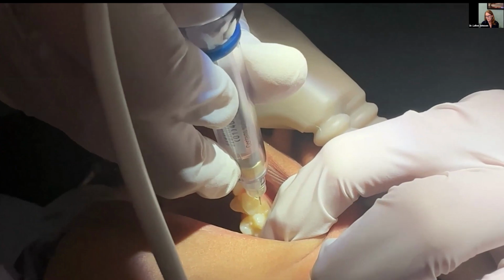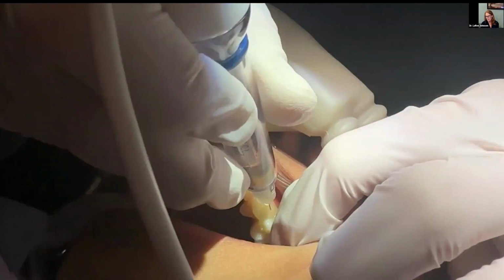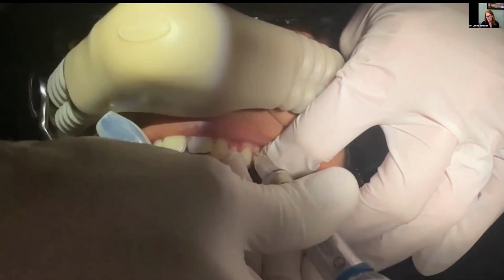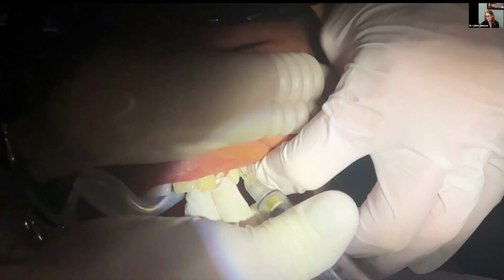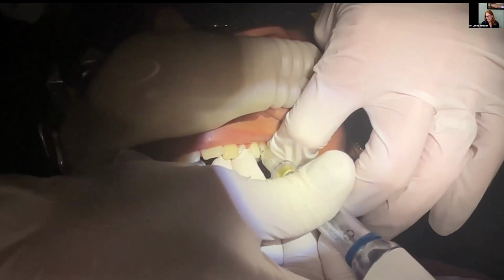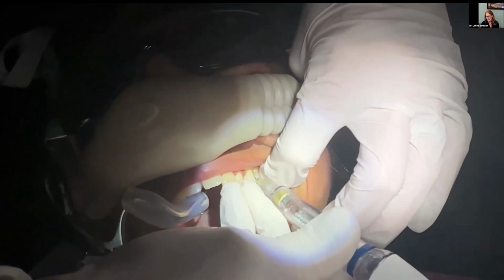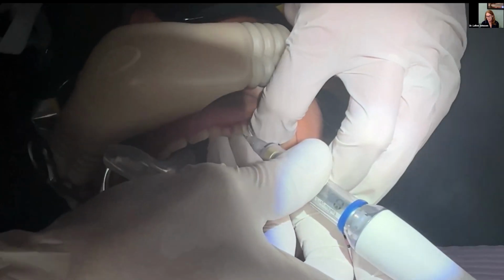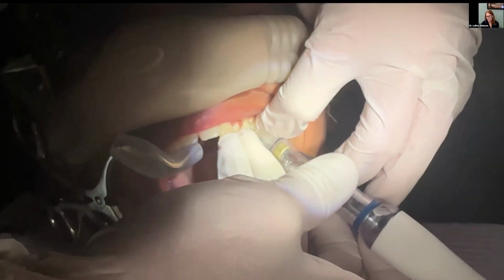And what I'm going to do, over blanch, as we all do, and then we're going to come out and come in and pop through that cortical plate, and shoop, it goes right in, and I'm leaving 1 to 2 millimeters out. Now you'll see me look with the mirror in just a minute. If I'm satisfied with seeing that blanching on the palatal, I'm only going to give 1 injection. If I'm not, I'm going to go to another place and take a look here in just a minute.